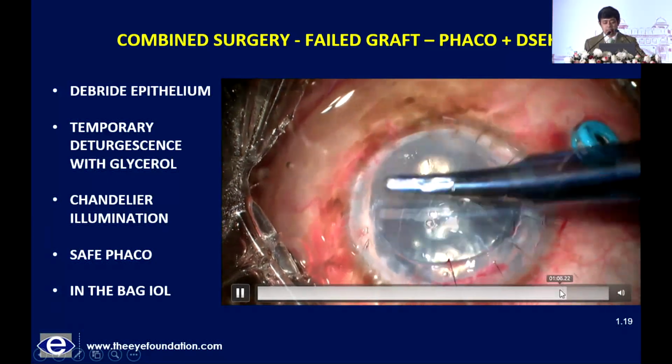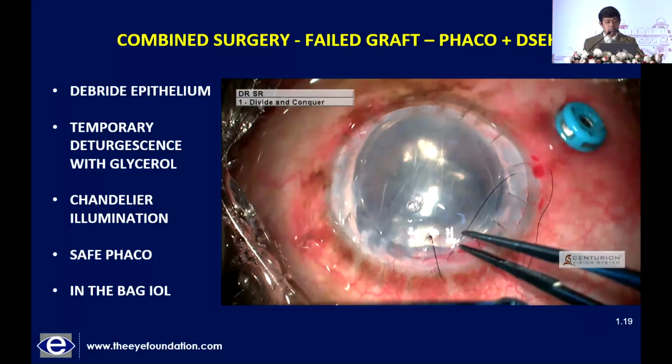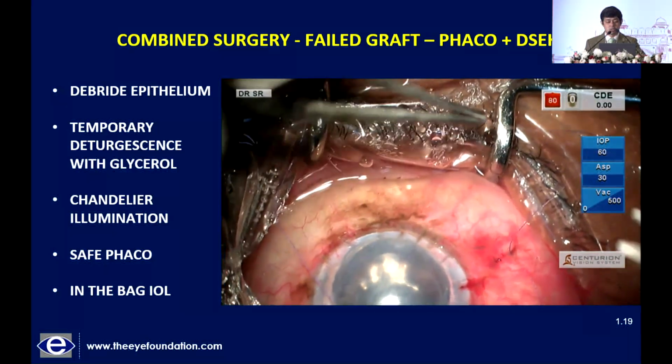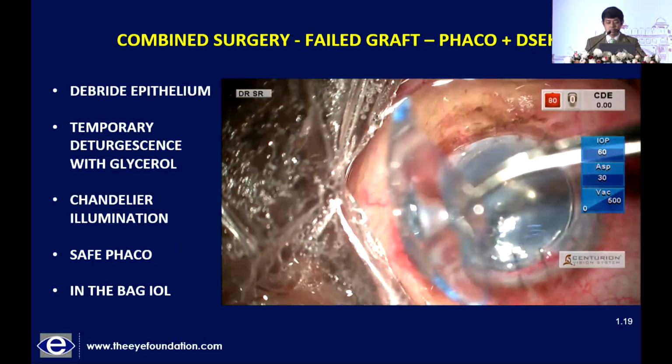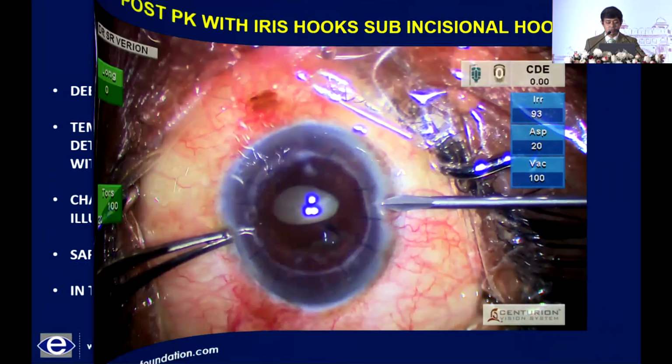Air bubble should be as tight as possible. Needless to say, close all the ports and suture them well, and venting incisions can also be prepared because it's a large graft and you will rarely get a very tight fill.